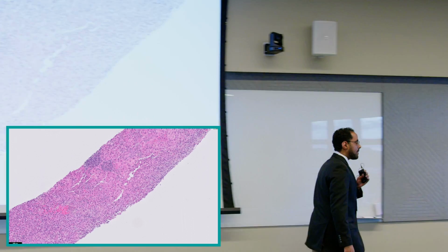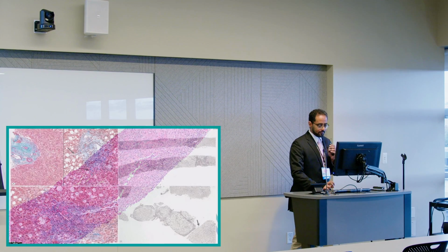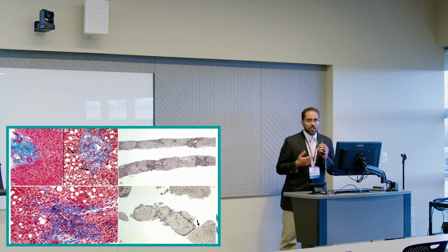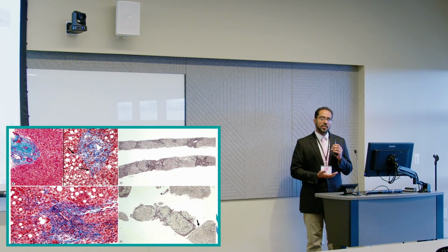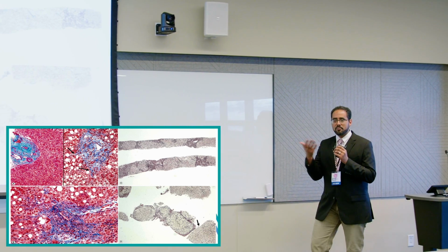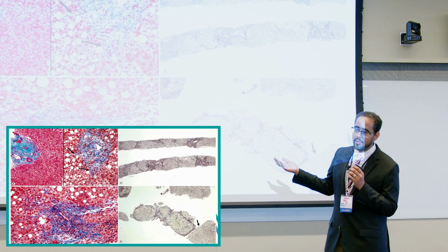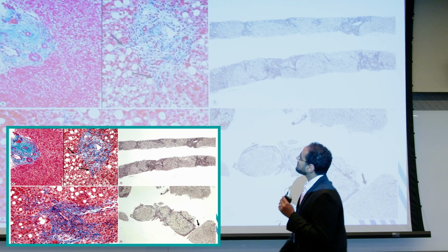Most of the time we get the fibrosis, what we call the staging, when we have chronic injury. So this is just a picture with our beautiful colors. That's what I do and enjoy, seeing all the different colors and the different patterns. You might not enjoy it. You just pretend it looks nice. It looks pretty good. I tried to convince my wife this is blue wallpaper, but she did not buy that.